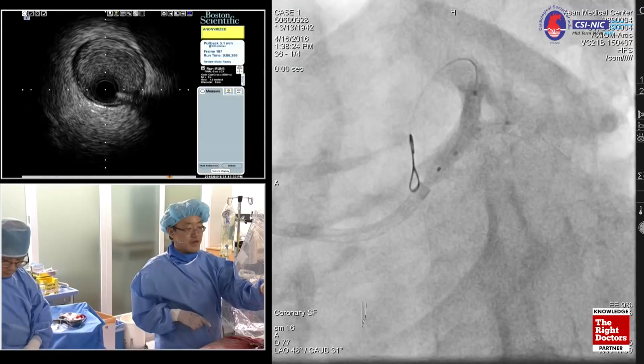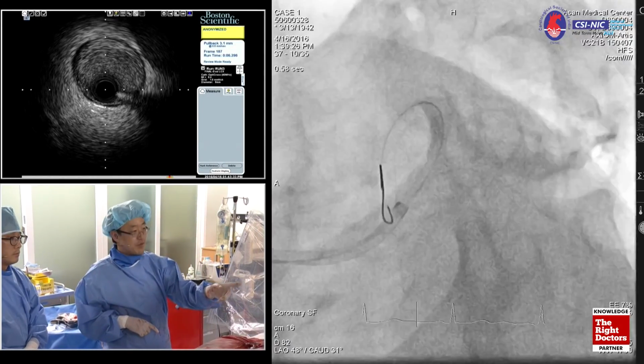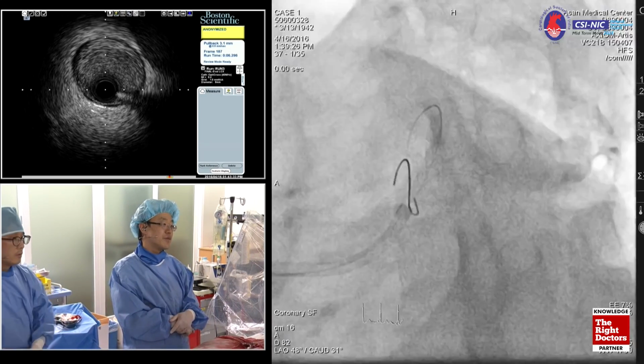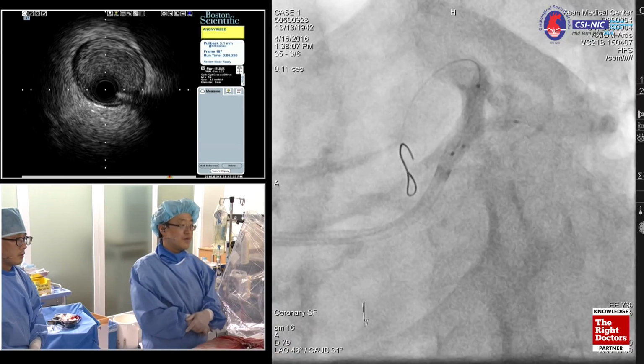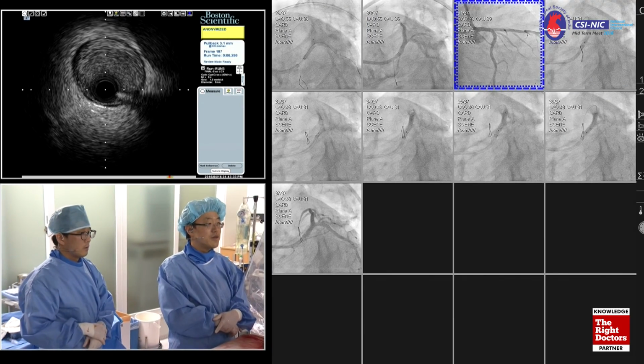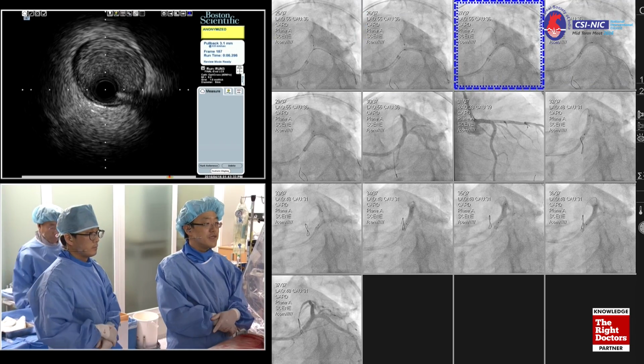Okay. Could you show us the DB balloon? Okay. This is the final DB.